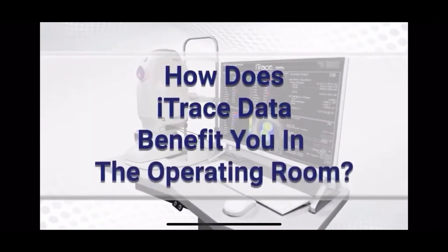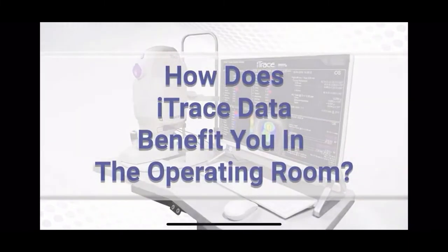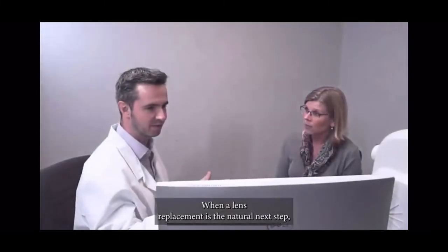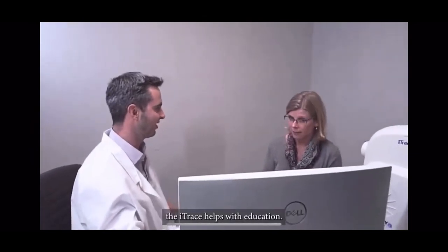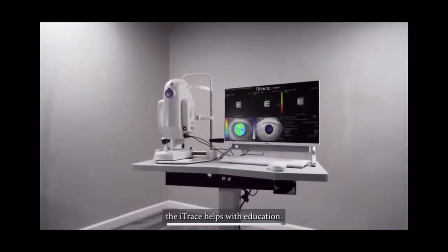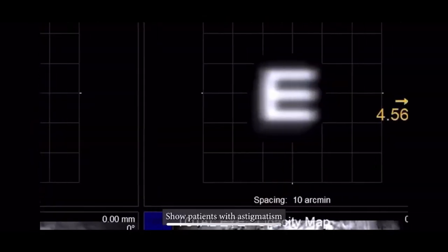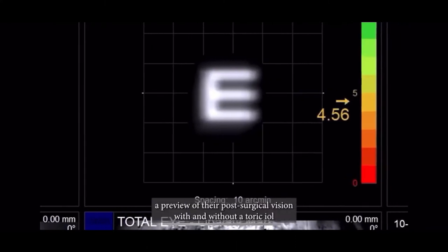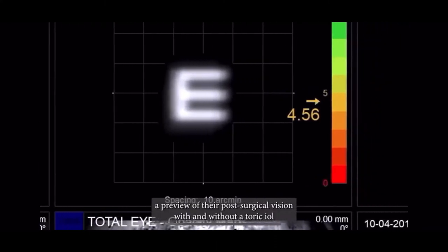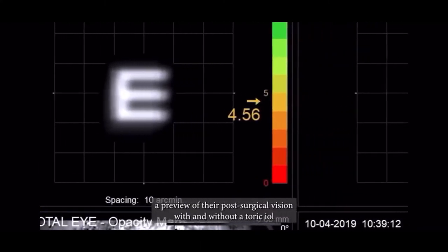How does iTrace data benefit you in the operating room? When a lens replacement is the natural next step, the iTrace helps with education. Show patients with astigmatism a preview of their post-surgical vision with and without a TORIC IOL.